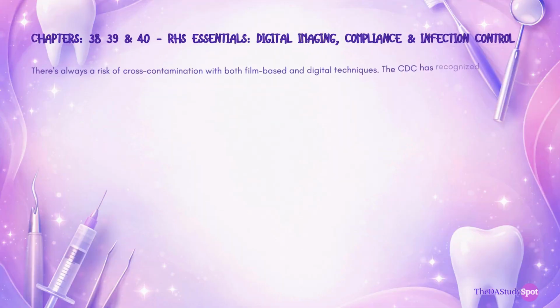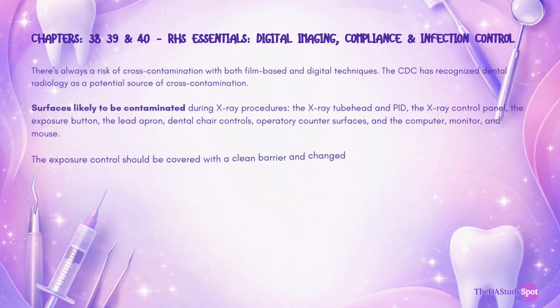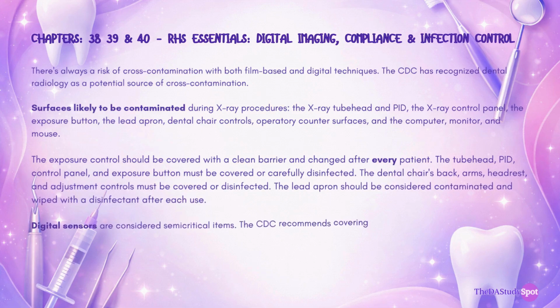This is the last section, but it is the biggest because it ties directly into your infection control knowledge, but applied specifically to radiography. There's always a risk of cross contamination with both film-based and digital techniques. The CDC has recognized dental radiology as a potential source of cross contamination.